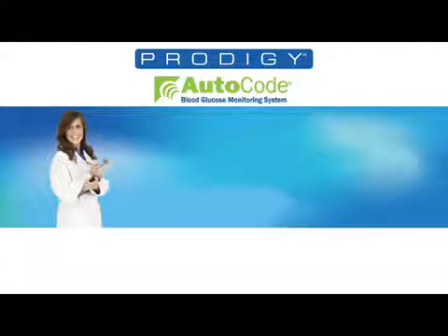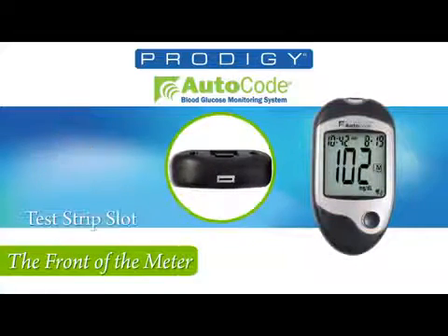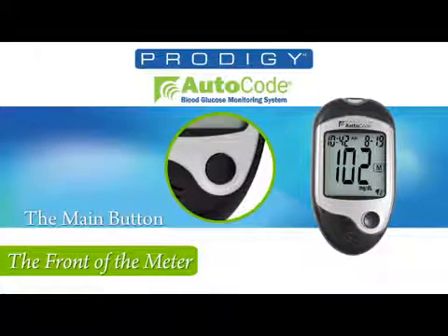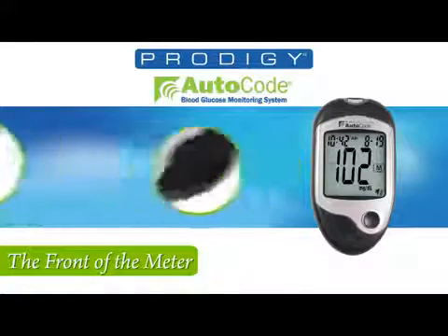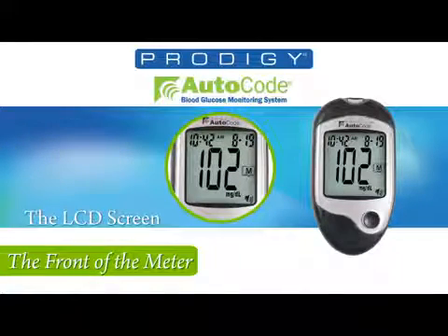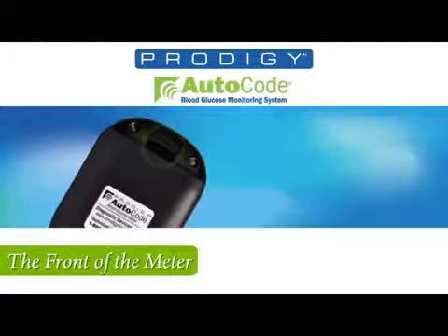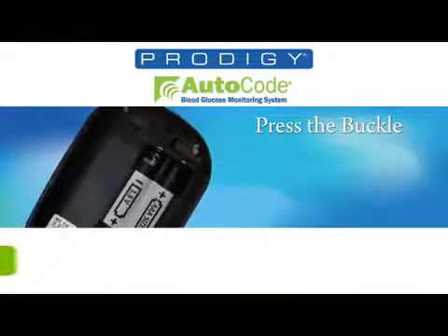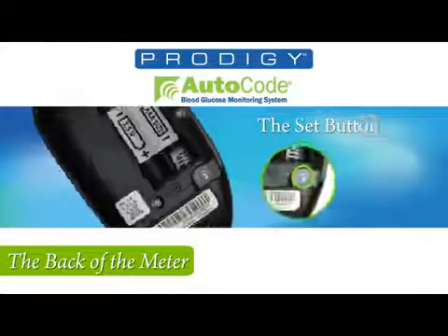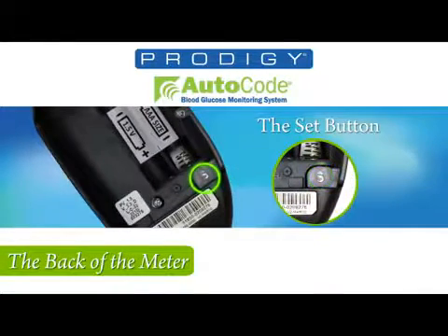Let's take a look at the front of the meter. Starting from the top, you'll see the test strip slot, then the M button. On the bottom of the meter is the USB port and the speaker. Finally, you will notice the LCD screen. Now looking on the back, you will find the buckle.